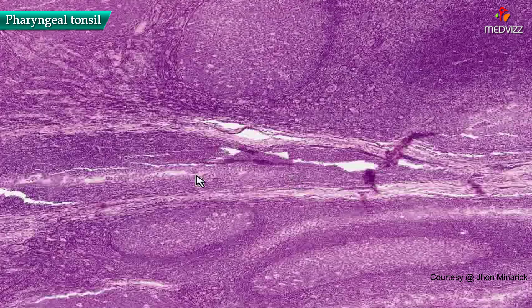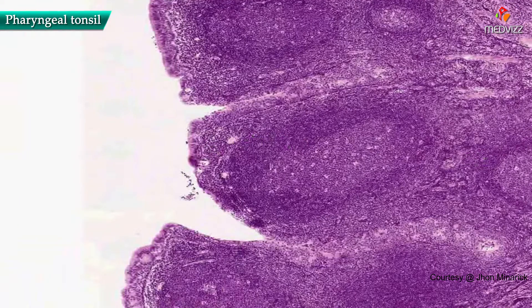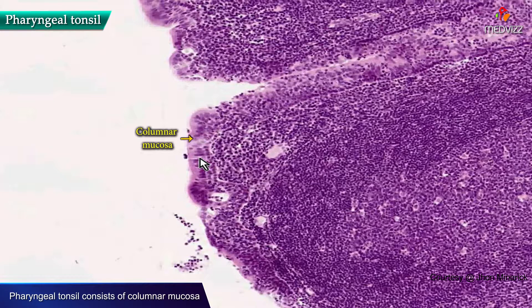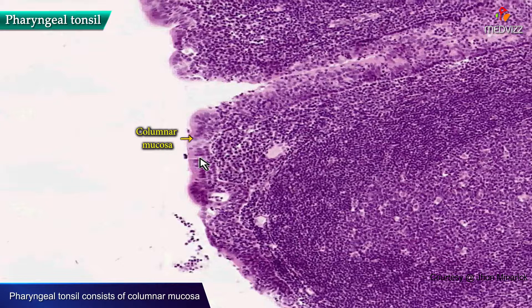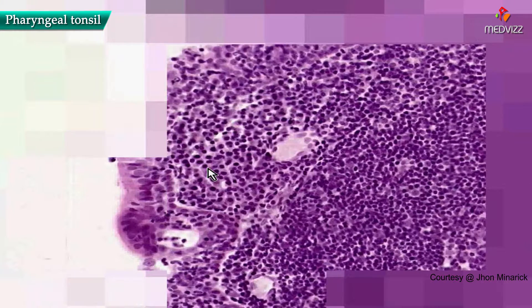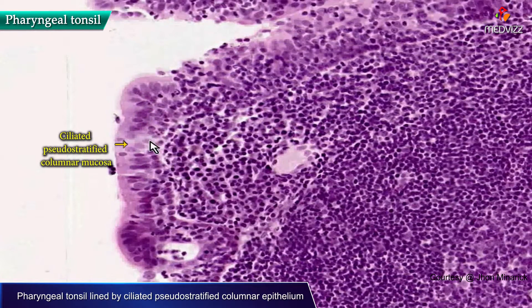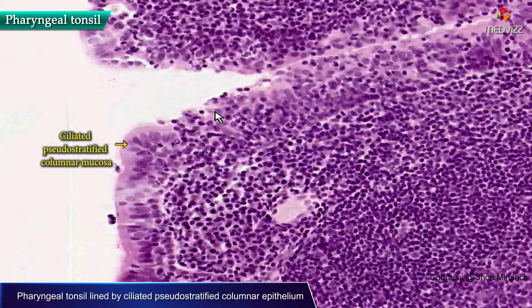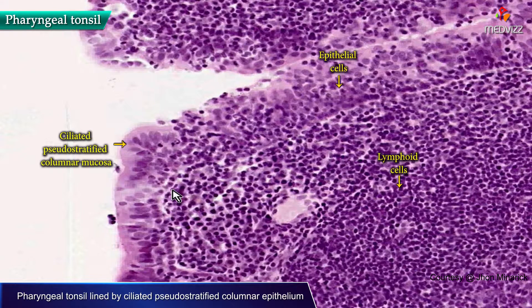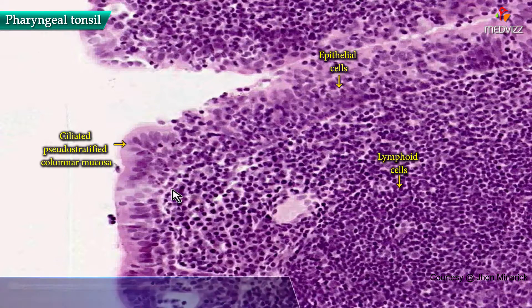But what they do have, at the periphery, is some type of mucosa and it is really not squamous — it's columnar. So we know that these tonsils are something other than palatine tonsils, and because the normal mucosa of the nasopharynx is a ciliated pseudostratified columnar epithelium — like we see here — which slightly enters into the lymphoid area to increase the interface between the lymphoid cells and the epithelial cells, this is a pharyngeal tonsil found in the nasopharynx.